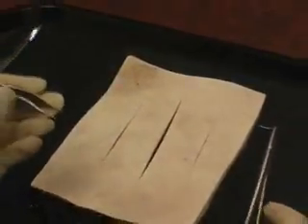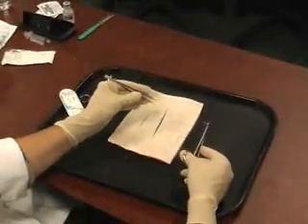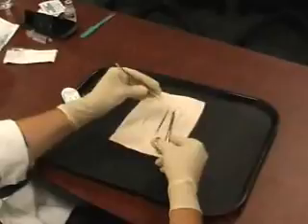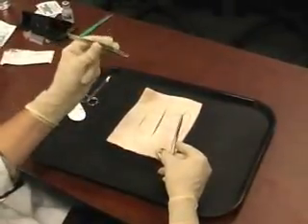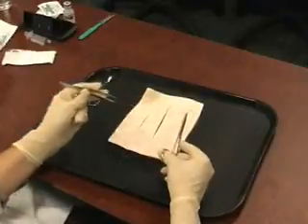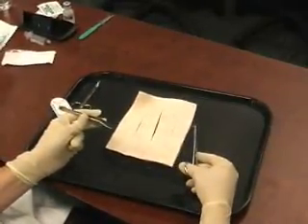What a lot of students do initially is suture one-handed, but remember you have another hand that you're going to use to hold tissue to give some counter traction so that you can pass the needle through the tissue easily. So use this other hand if possible. What we're going to go ahead and do is a simple interrupted with an instrument tie.